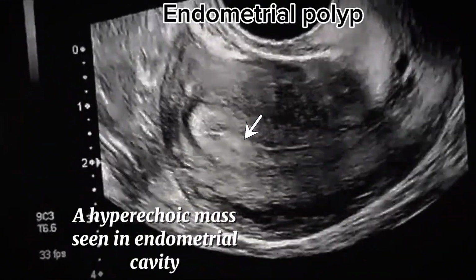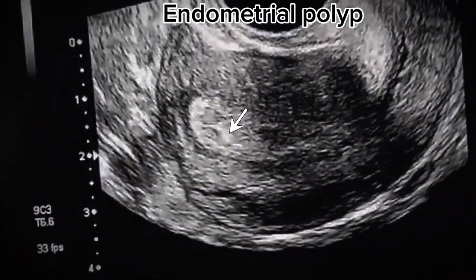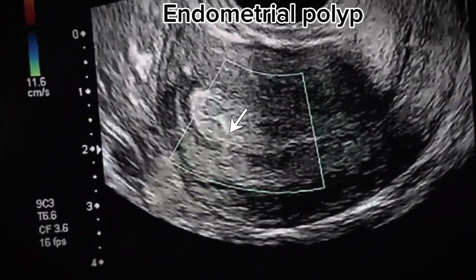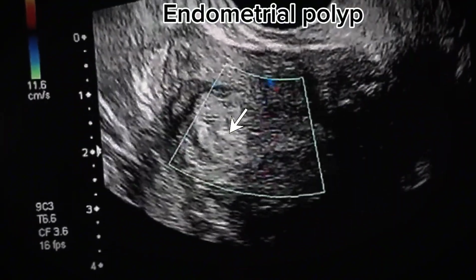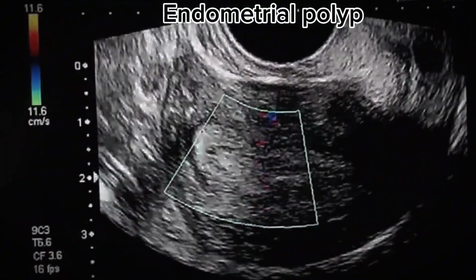On Doppler study, minimal vascularity can be identified. This is a case of typical endometrial polyp which was identified on transvaginal ultrasound.